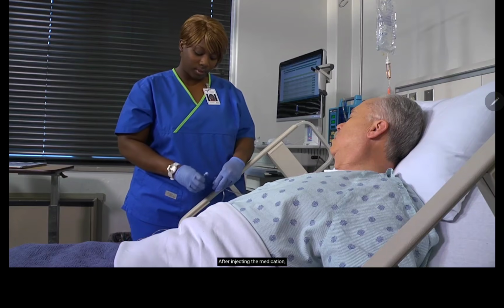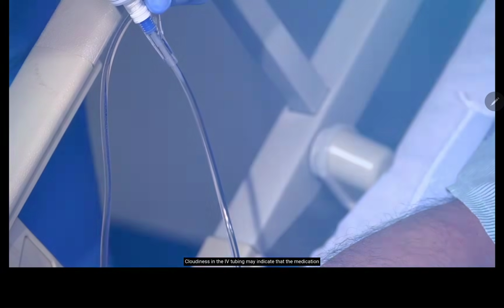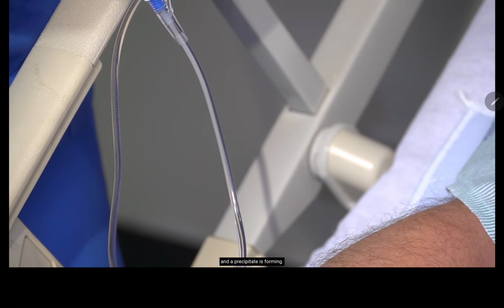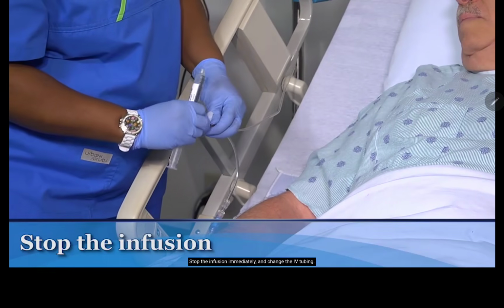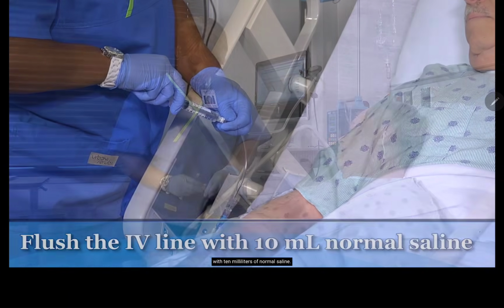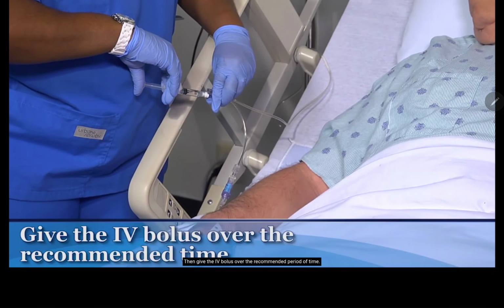After injecting the medication, withdraw the syringe and recheck the IV infusion rate, adjusted as needed. Cloudiness in the IV tubing may indicate that the medication is incompatible with the IV solution and a precipitate is forming. Stop the infusion immediately and change the IV tubing. With the new tubing in place, pinch the IV line and flush it with 10 milliliters of normal saline. Then give the IV bolus over the recommended period of time.